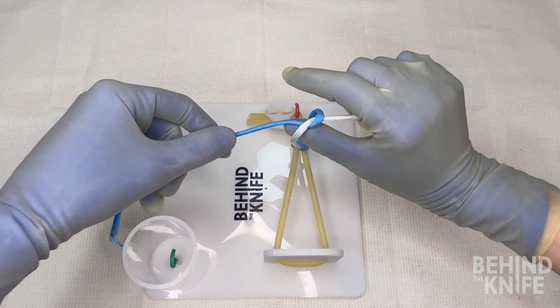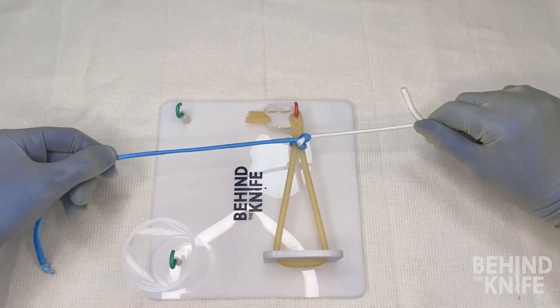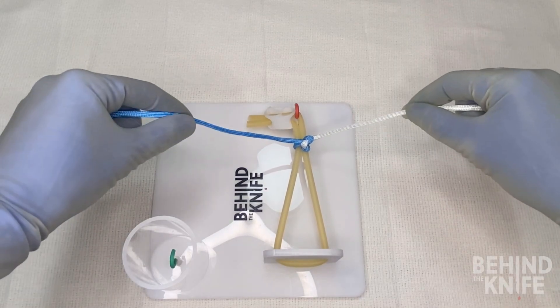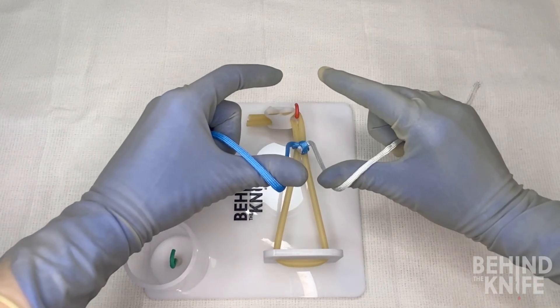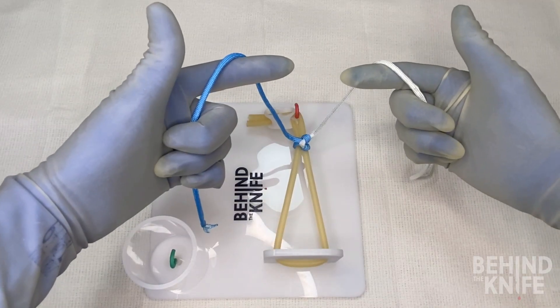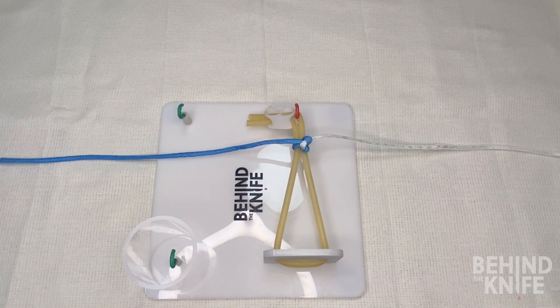Since we crossed our hands last time, we don't need to cross our hands this time to throw down a nice square knot. To continue, you'll move back to making your L's with both of your hands to throw your next knot, then back to your C's for the knot after that — alternating back and forth between L's and C's for each knot so that you'll always throw square knots. And that is how you do a two-handed knot tie.